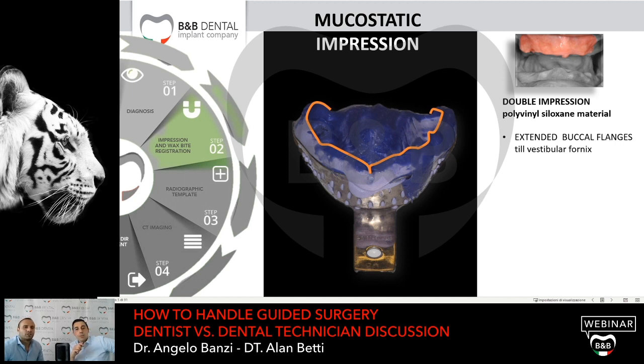Most doctors ask me if polyether is a good material for this impression, and actually it is as good as polyvinyl siloxane, even if in literature there are some cases where the double impression seems to be a little bit more precise than the polyether material.